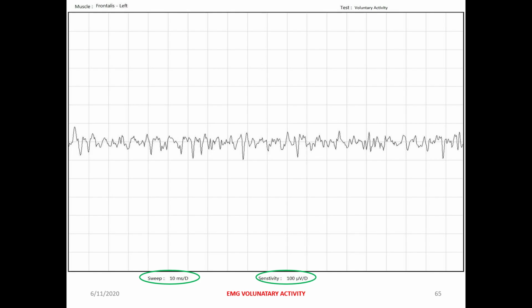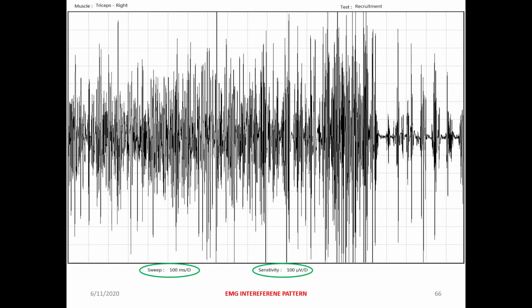Now, this is the interference pattern. That is checked with resisted movement. Ideally, this blank part that you can see should also be covered with this particular color. This is a black and white report, but on screen it may be red or yellow, based on the different software. If it is red, you can ask your patient to cover the whole screen with red color. That will be one of the motivations.